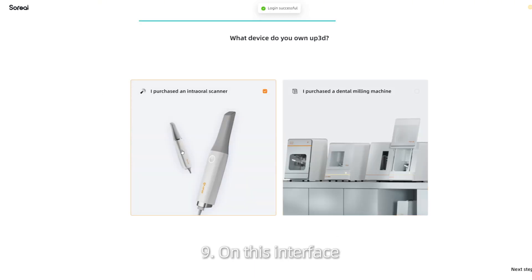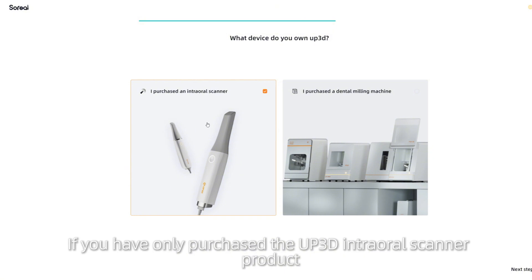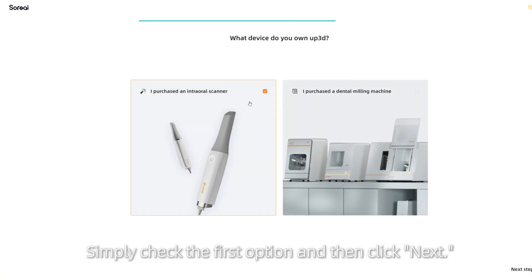On this interface, if you have only purchased the UP3D intraoral scanner product, simply check the first option and then click Next.